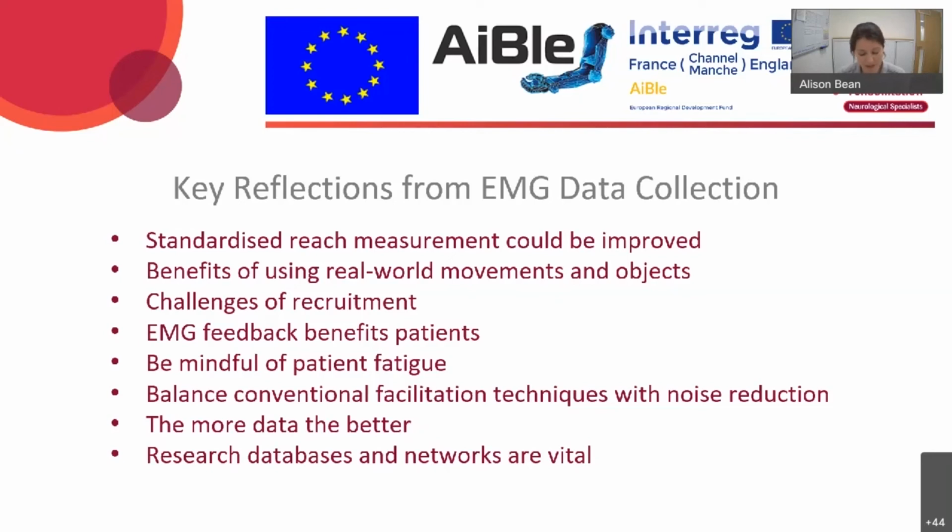Regarding the EMG collection itself, it was clear, as I said, how patients viewing EMG traces in real time was of huge benefit to their movement modulation and ability to recruit their movements appropriately. And it's certainly a feedback technique we could explore further in future. Whilst we had a standardised procedure to follow, we had to be mindful of patient fatigue. And as previously mentioned, there needs to be more hands-off to prevent noise and allow for true EMG signals, which went against some of our more conventional techniques. But there were also patients who generated larger signals when we stopped facilitating, assuming because they had been accepting more of our help than they perhaps needed. And that was also interesting for us to see.